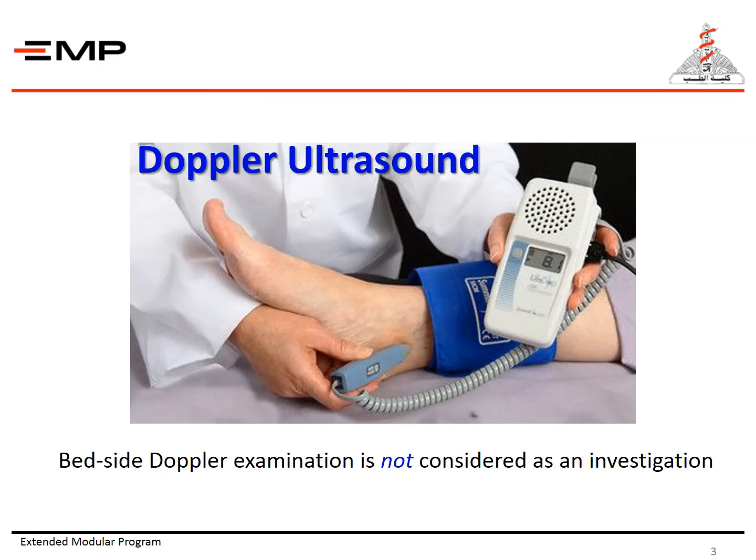If you suspect that your patient is having a lesion along the arterial tree causing occlusion or stenosis, vascular imaging can give you more information about the site, the extent, and the nature of the lesion.